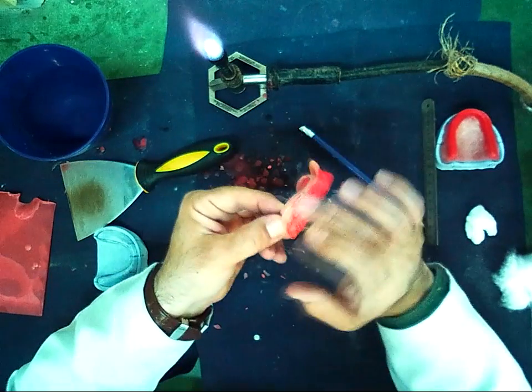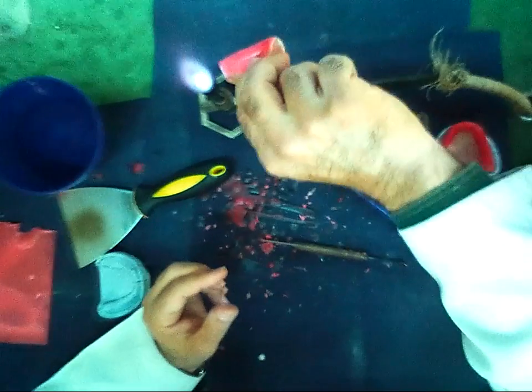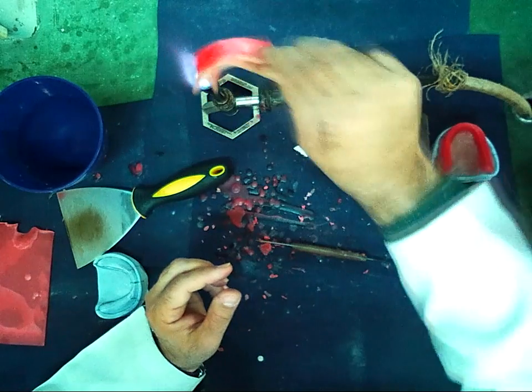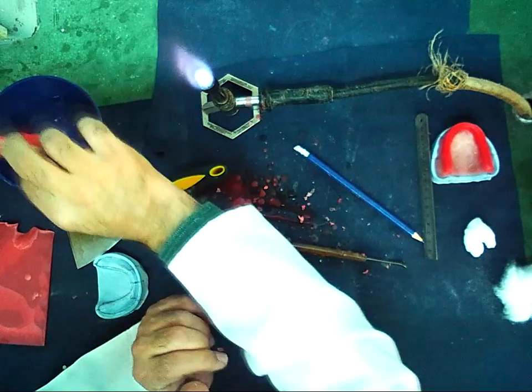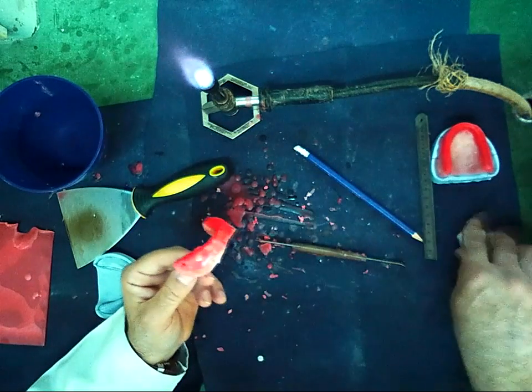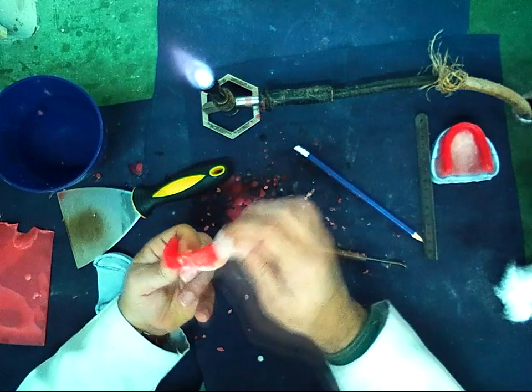Now I need to make it smooth, using cotton.